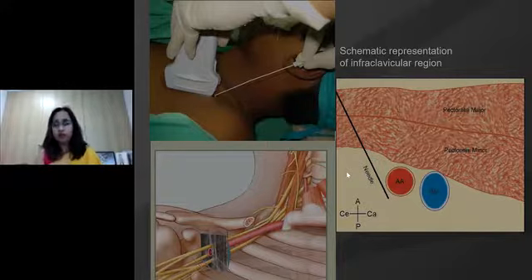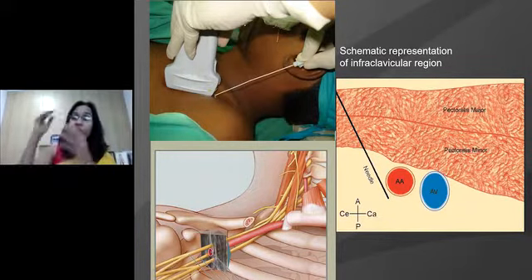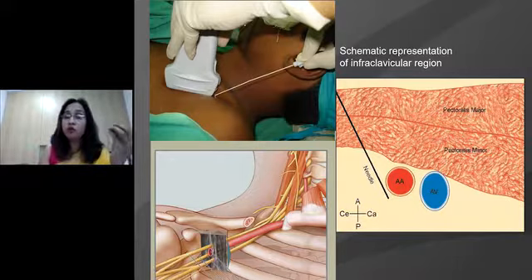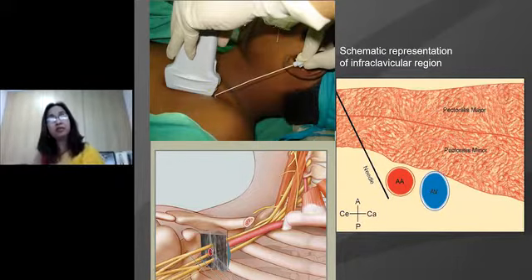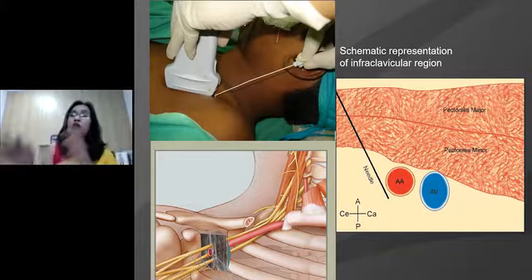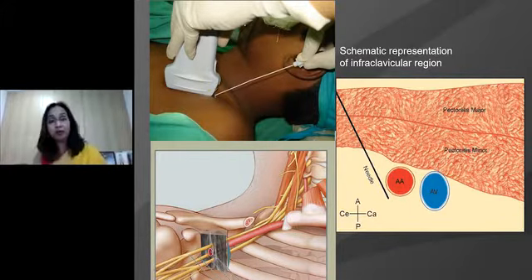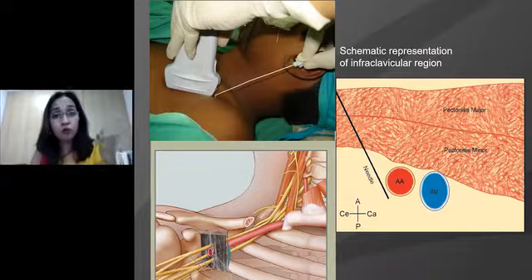Coming to infraclavicular, nothing is more helpful than infraclavicular in adolescents, because most of the time the injuries are on the elbows, or in small children, very small, say 8 months, 9 months. This is the typical age where they come for radial club hand repair, and radial club hand is a tricky congenital anomaly where the radius is absent, and the muscles arising from it are absent, so the end motor response that we could otherwise have elicited with the PNS is going to be a little blurred and confusing. So we are going to depend on ultrasound to get a good block.